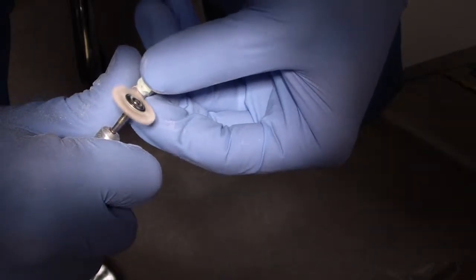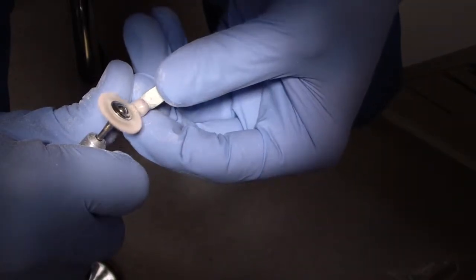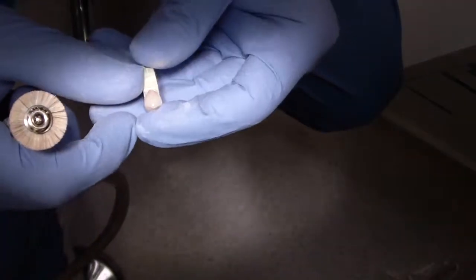We've gotten rid of most of the big scratches from the diamonds that I was using. That gives us a rough sheen.